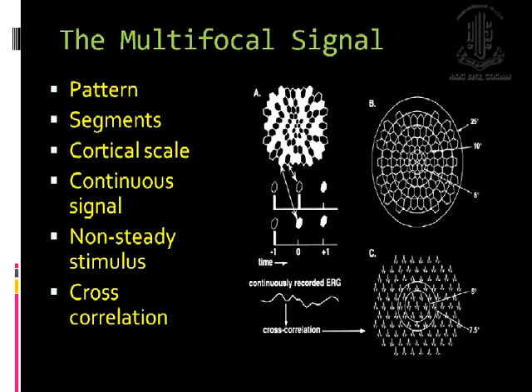Now, the segments, as we said before, range between 61, 103, and 241. Each one covers a wider range and a smaller degree of focusing on the retinal segment. Of course, these hexagons are cortically scaled, meaning that the center 2.5 degrees represents the fovea.